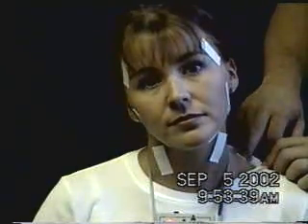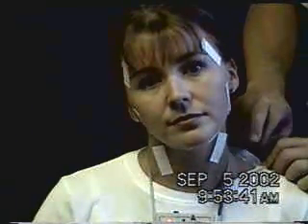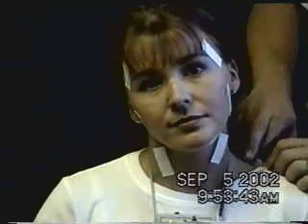The last electrode we want to attach is just right here on the shoulder. This is the ground electrode. All we need to do is stick it there, but remember you also need to clean the skin there as well.